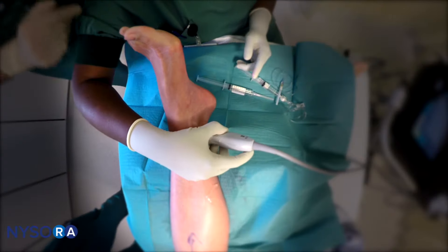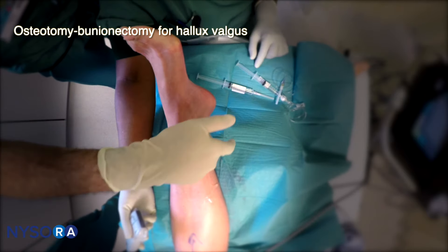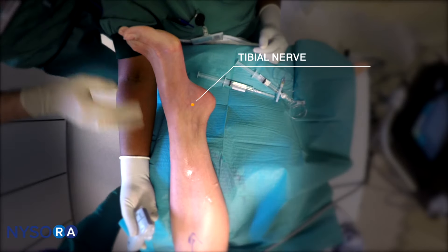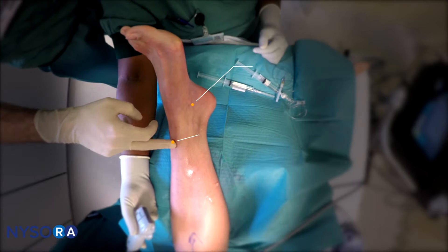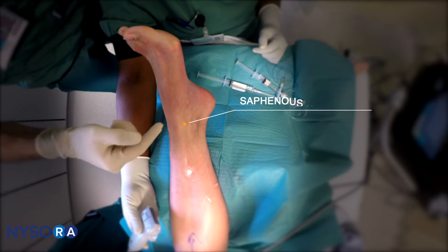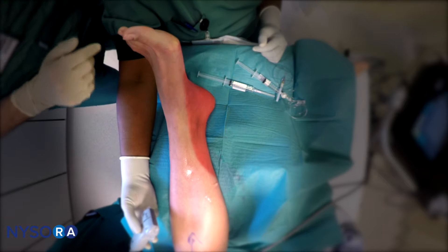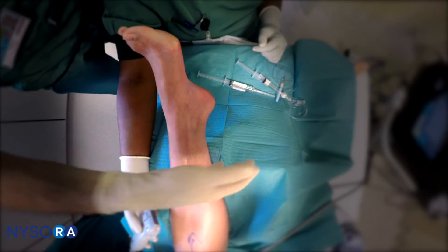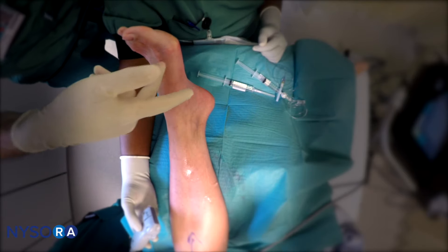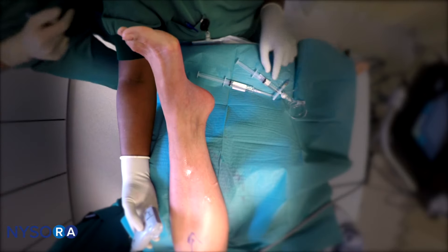In an ankle block, the most important nerves for this operation are the tibial nerve, which anesthetizes most of the territory of interest, and then the deep peroneal nerve. The saphenous nerve is not always necessary because it reaches this area only in a minor percentage of patients. You can do a saphenous nerve block, but a simple infiltration proximal to the site of surgery is sufficient in most cases.